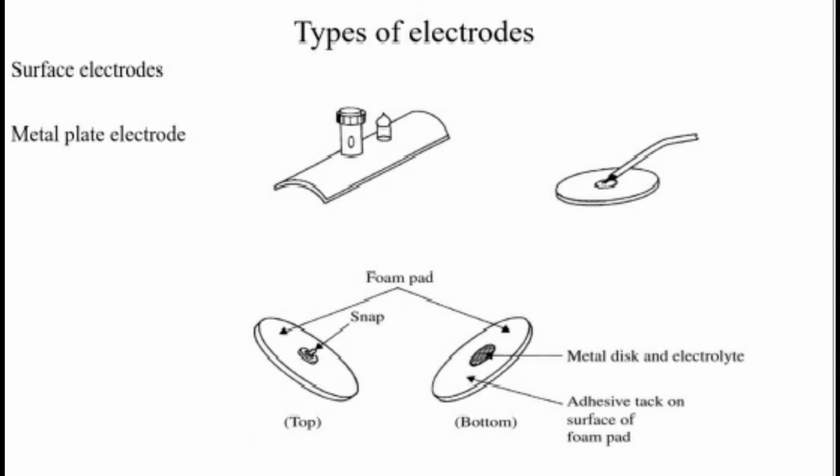Rectangular and circular plates of German silver, nickel silver, or nickel plated steel are used as surface electrodes in the case of ECG measurement. When these electrodes are applied on the skin with electrode paste, the high frequency impedance amounts to a few hundred ohms. The DC resistance values are in the range from 2 to 10 kilo ohms.